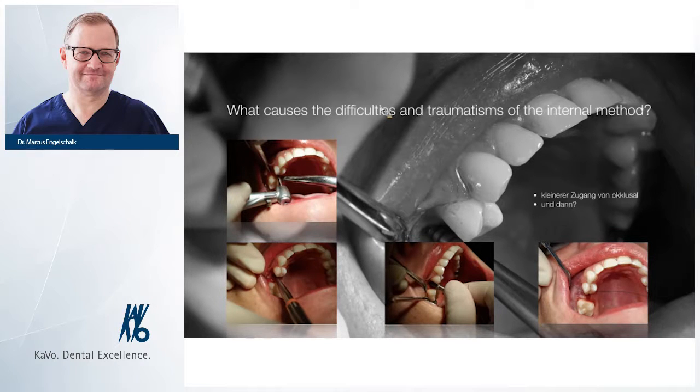Well, safe entry is a problem for osteotome and balloon because there is a fracture of the residual bone, the osteotomes, and you just can open or elevate the bone by fracturing it. And these sharpening edges are the problems for this technique.